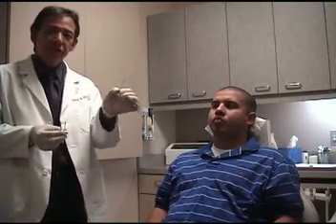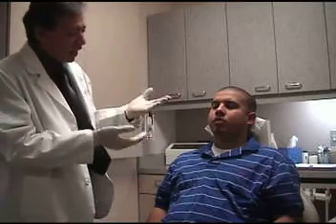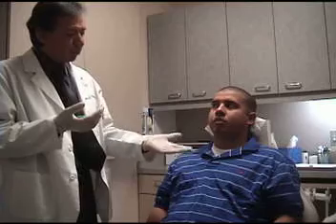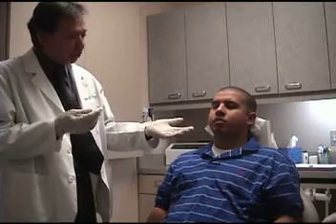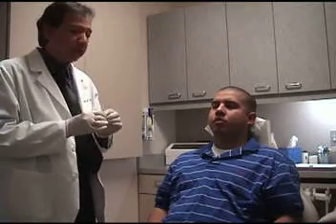So of the three mediums that we would use to stabilize the mandible in this position, we would want to have the smallest, and we would use the tip of this micro brush here. Okay, so what we're going to do is we want to capture that and get the patient to stop in a position, an upward movement of that mandible, and capture them at a point that is the same diameter as our separating medium. Okay? So we need to time that, and we need to go through this, we need to practice.